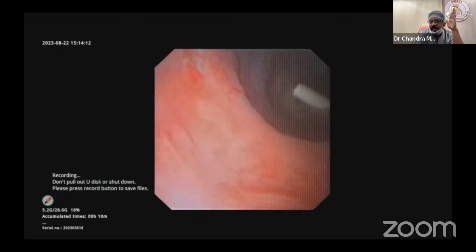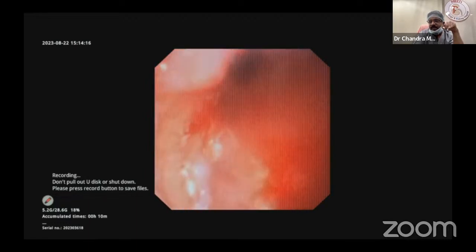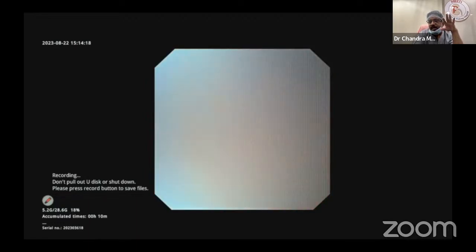So here, I am showing a combination of flexible cystoscopy because the latest flexible nephroscope or cystoscope are highly flexible with this tip. This is from Biorad. Any company, and in future another company may come. See the air bubble shows the top.